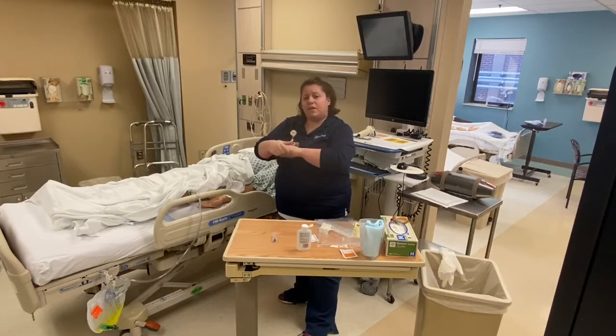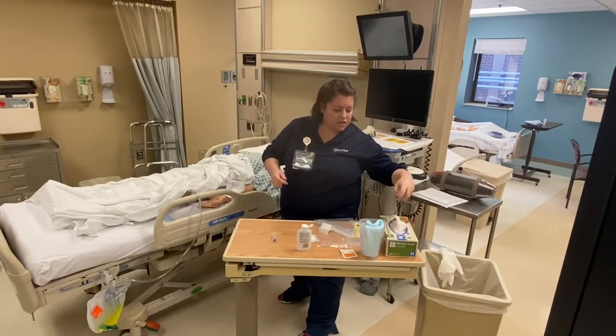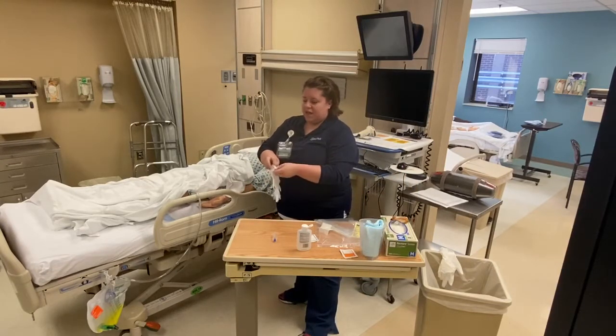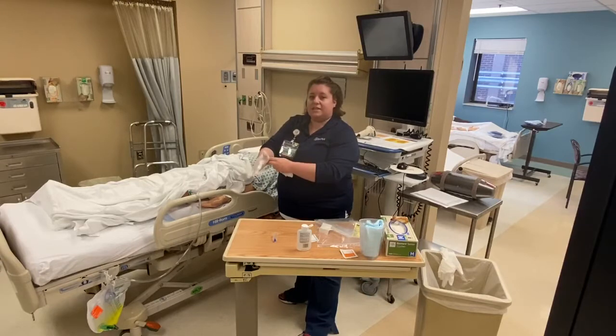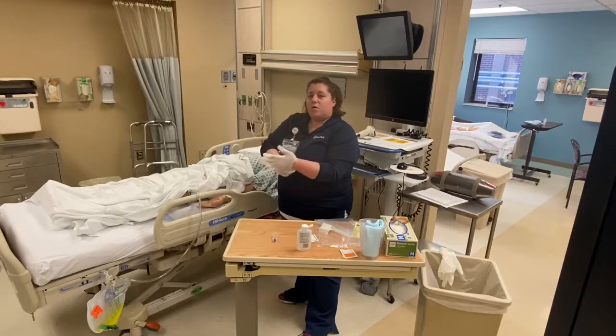So how often do you empty a Foley bag? For one, the physician is gonna order I's and O's every so many hours. If you're in critical care, like the ICU, it might be every hour. If you're on a med-surg or telemetry floor, it might be every 4 hours, every 8 hours. So you'll follow that order.